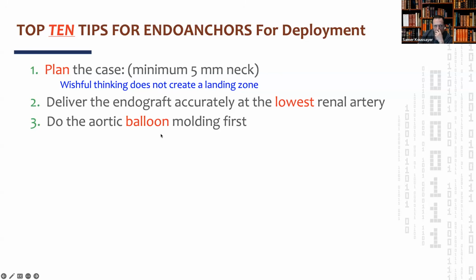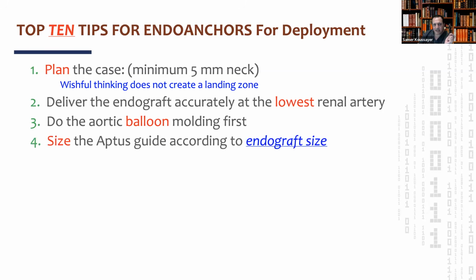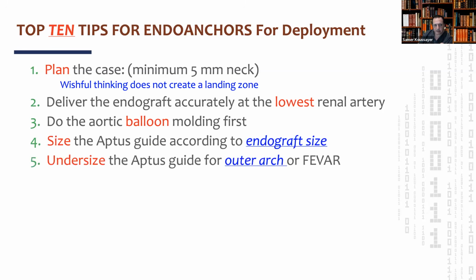Okay. Do the ballooning first. Before you deploy, always do ballooning, because the balloon will push the graft to the aorta and make it closer, and this will help your endo anchors penetrate better. Size again according to the endograft size. This is more difficult for the arch.